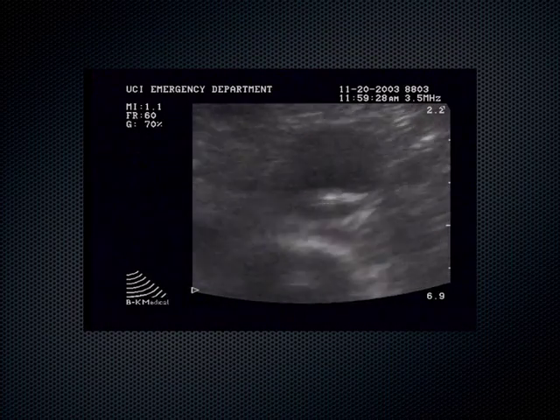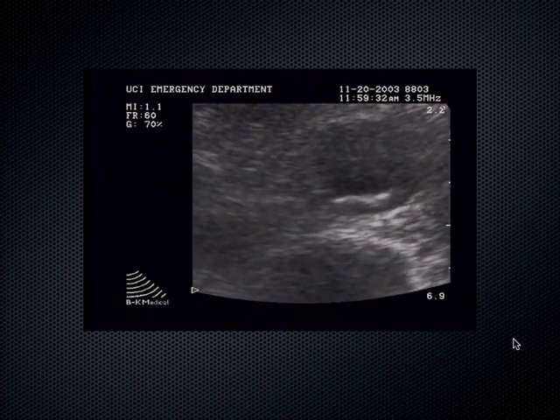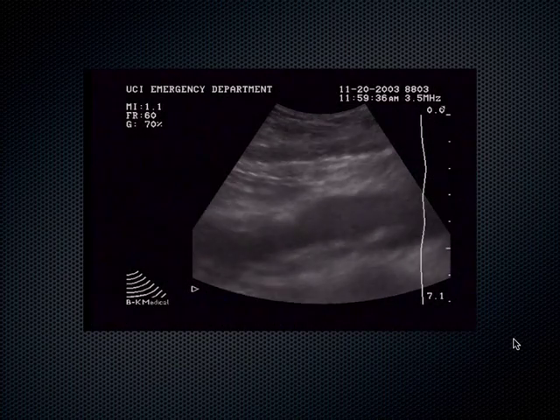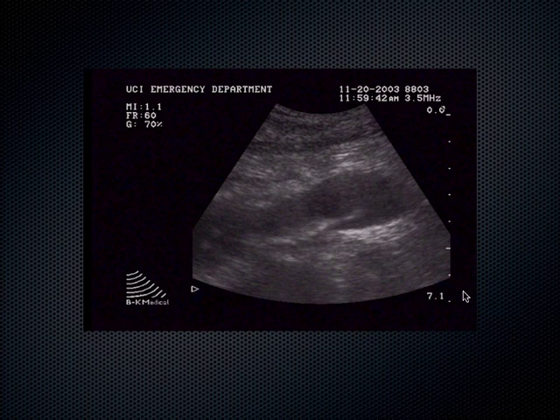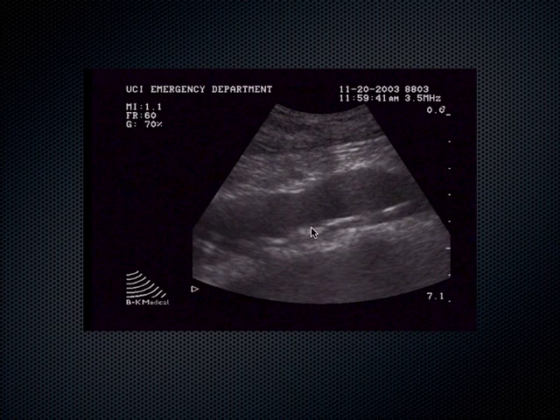What's this diagnosis? Here's the spine shadow right here. We've got it zoomed. Our depth is pretty decreased. What do you think's going on here? We're in the sagittal plane now. Pay close attention to this line right here. Why is it fluttering? What is that? How would you describe this?